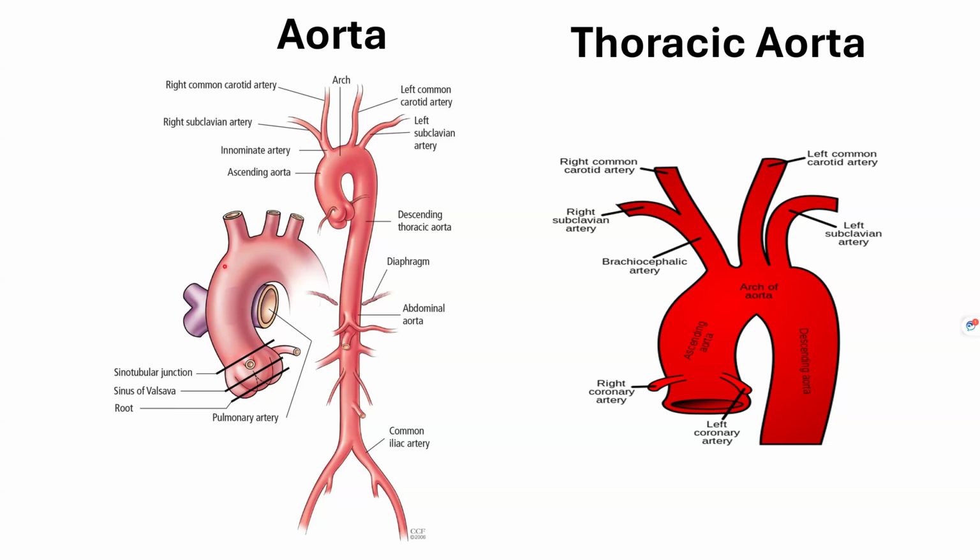And sometimes even for distal, they clamp right here, sideways. Most of the times in that scenario, I have seen my surgeons saying that they put a clamp above the pulmonary artery. Yeah, I see it sometimes. Okay. So it's small things, and that was very helpful.